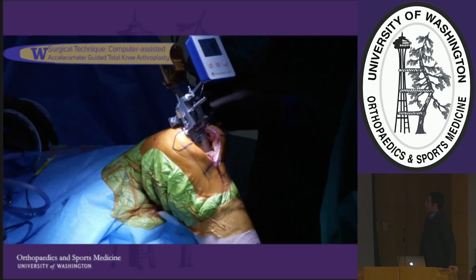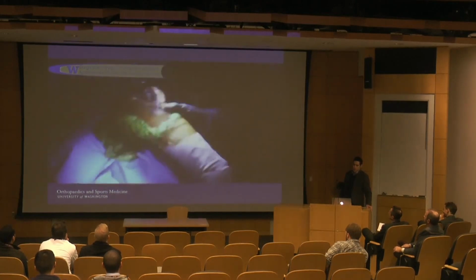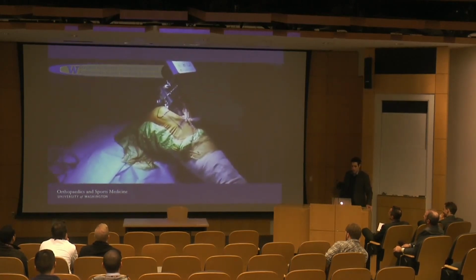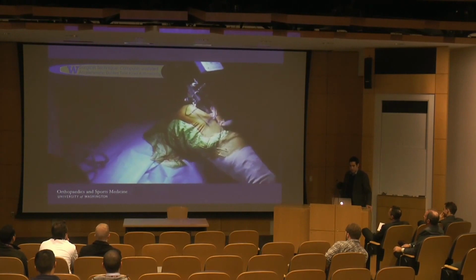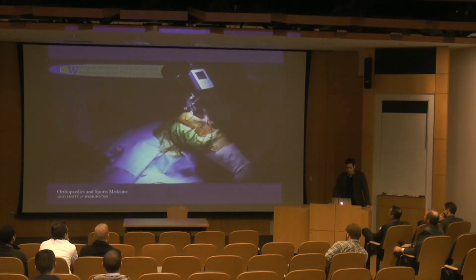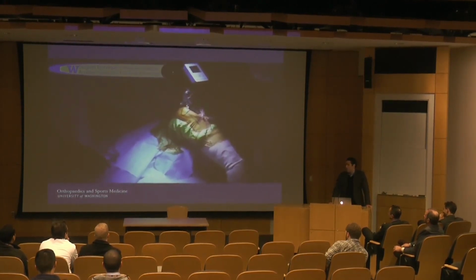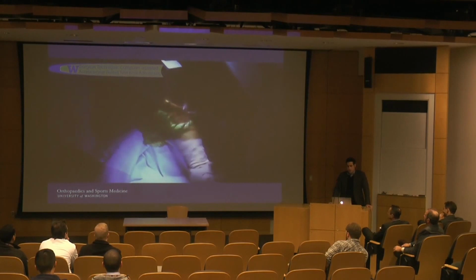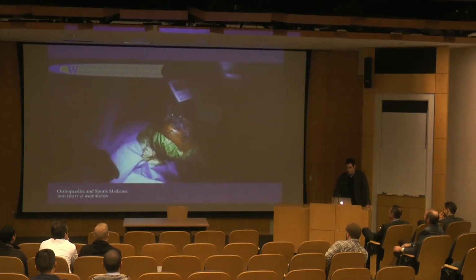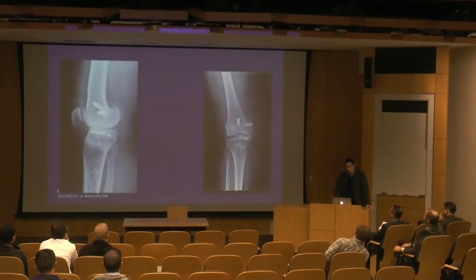So it's a system that's set up, basically attached to standard distal femoral resection guides, and that's how you register the center of rotation of the hip. It's a very simple maneuver, and then once that's registered, you dial in to the console the slope of your distal femoral resection, as well as the varus valgus angulation. And so in my practice, I've been using this mostly in complex deformities in patients.